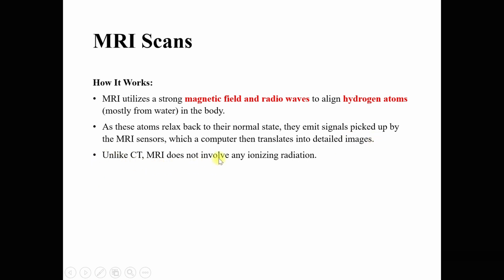Unlike CT, MRI does not involve any radiation exposure. Rather, it uses a magnetic field and radio waves.